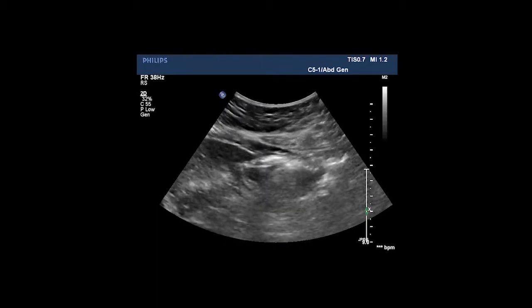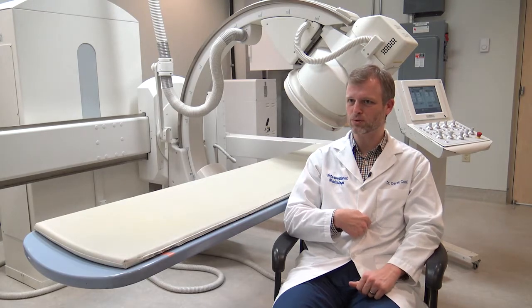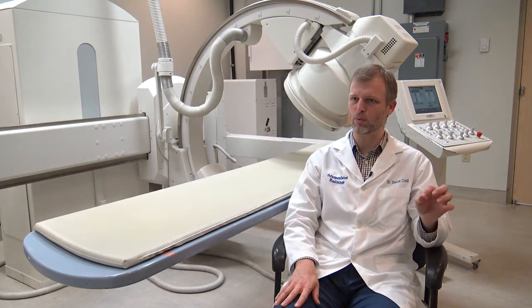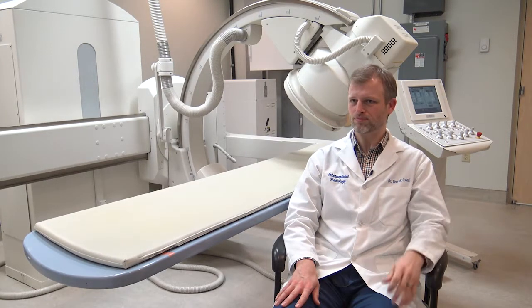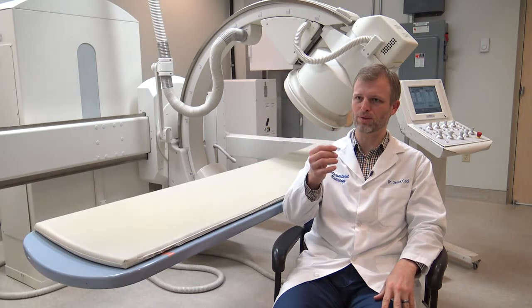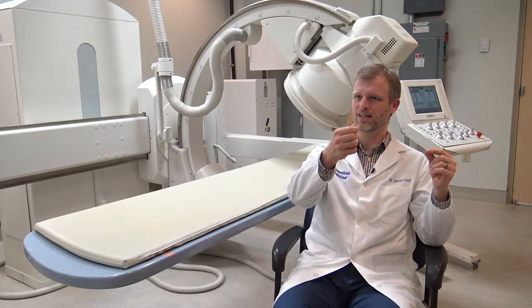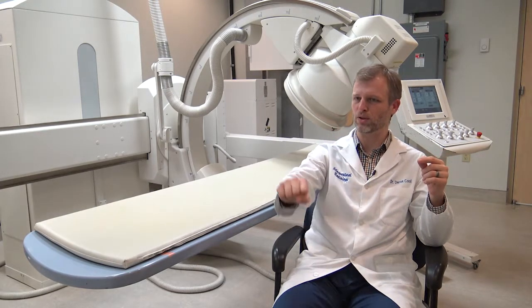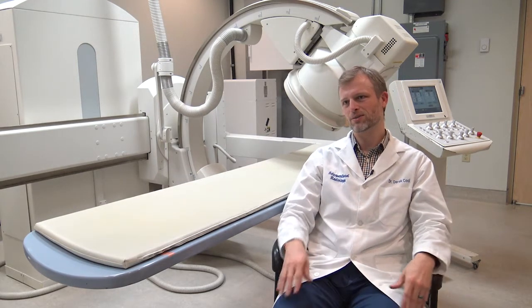And then we take a needle from the skin, through the abdominal wall, through the gastric wall, and right into the balloon. And then through that needle, we can feed a wire that's then captured in the balloon. It's pulled out of the mouth. And once the wire is out of the mouth, now we have a wire coming through the skin, through the stomach, out the mouth, and we can feed our tube from the mouth down and pull it all the way through, so that we're left with just the tube going from the stomach right out the skin for feeding.